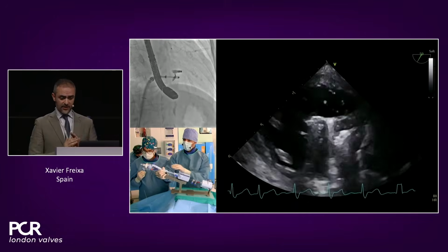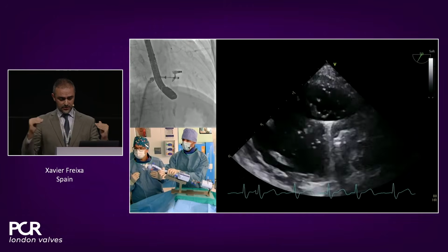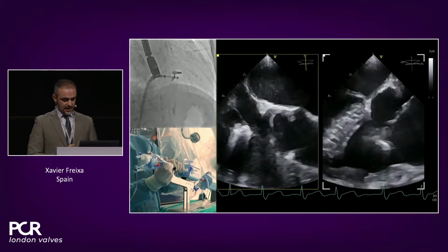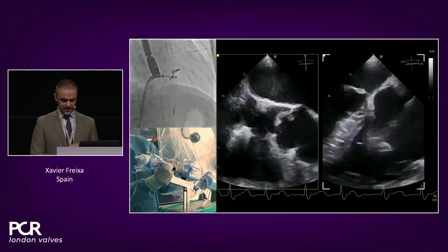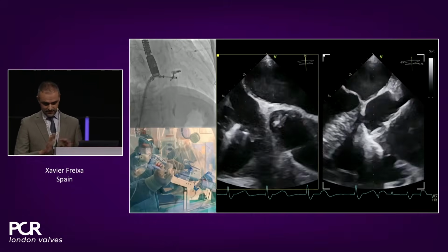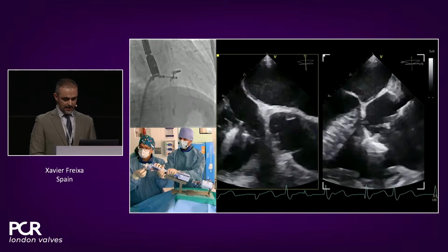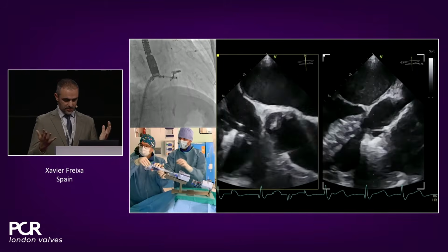Here it looks reasonable. It's completely horizontal from 9 to 3. It looks like we're grasping all the posterior. And now you'll see that both leaflets look in, clearly the septal's in. Maybe the posterior is not that clear, but the orientation was good, so we're going down.